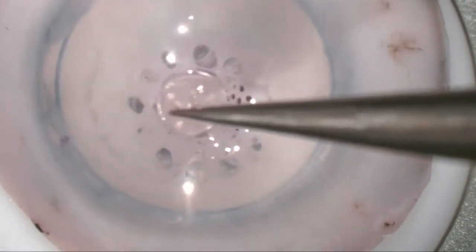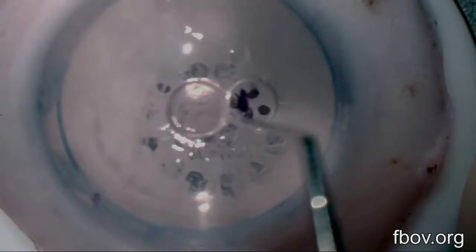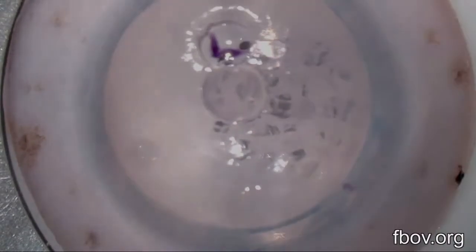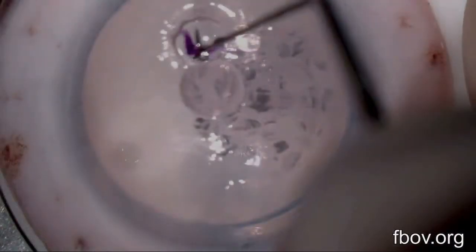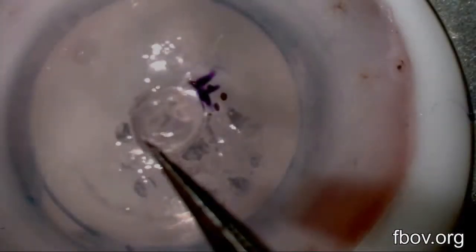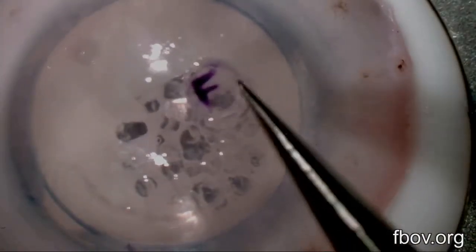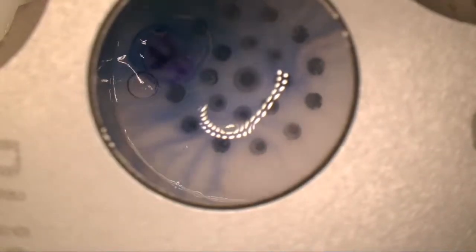The donor tissue is turned upside down with the endothelium facing downwards. The stromal plaque is removed and the Descemet side of the DMEK graft is marked in an asymmetric fashion. The donor tissue is placed back on the trephination block and the punch is used to cut the Descemet graft to the desired diameter. Minimal advancement of the blade into the tissue is required and this is obtained by simple tapping.